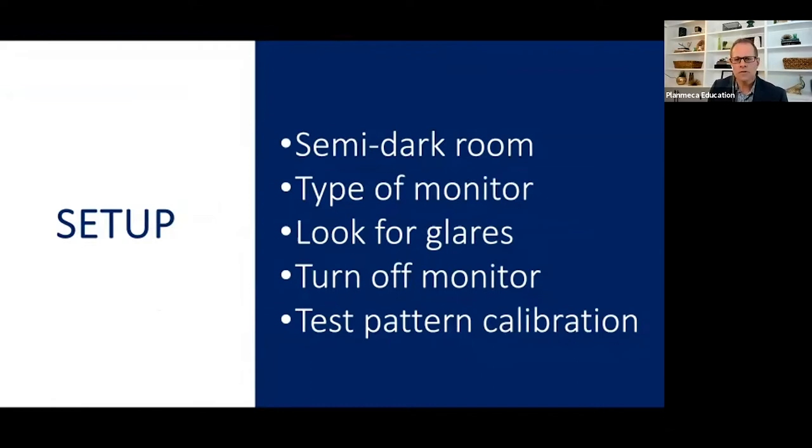So first of all, I would probably recommend that if you are going to view images, find a semi-dark room. Lighting is very critical. And as far as the monitor, most radiologists would probably agree that image monitor quality is important. Medical grade monitors are not necessary for viewing images, but just get yourself a good quality monitor based upon the specifications of the imaging software that you're viewing with.